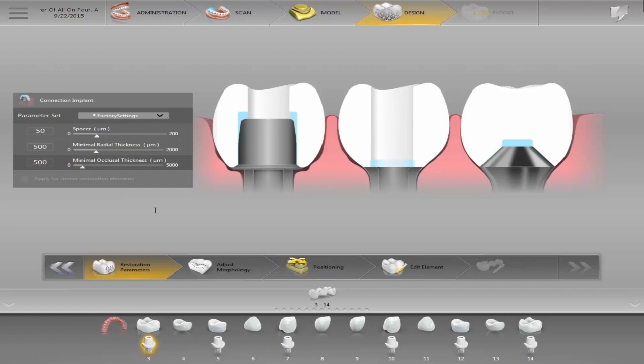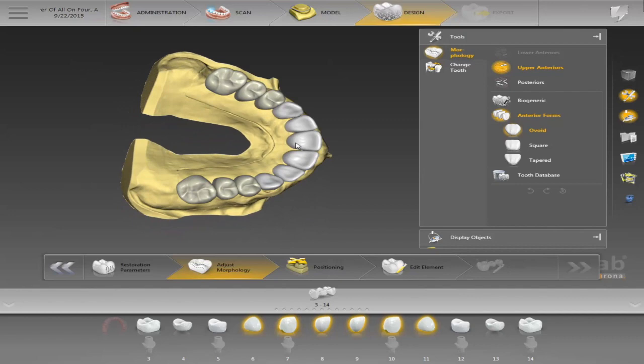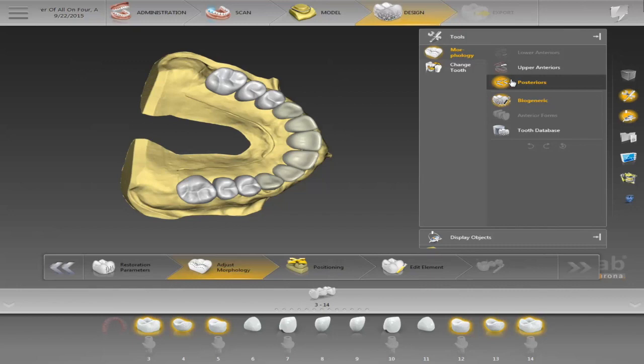One of the things we can do is choose the morphology of each case. We can use biogeneric crowns, or we can choose from the tooth library — we have VITA, Candulors, Merz — each one has their own libraries we can add. Normally, to be honest, I don't use them too much unless the doctor wants denture teeth. For the most part, biogeneric is my number one, especially in the posteriors.